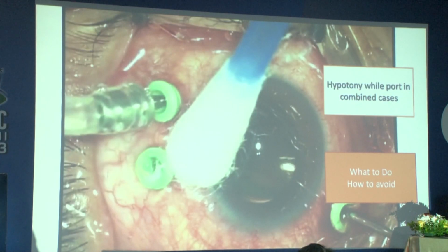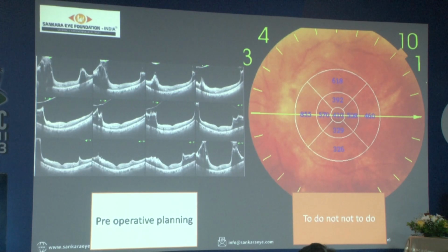That's true. I do vitrectomies with 2 cataract surgeons, and one cataract surgeon prefers that I actually make the ports before I start the cataract surgery. I don't switch on the infusion. I connect everything and then he does the cataract surgery. I'm not sure our cataract surgeons would be comfortable, because they want to finish their case and then go away. If you do a pre-fixed infusion, the cataract surgeon doing a temporal incision may find it difficult with that blocking.